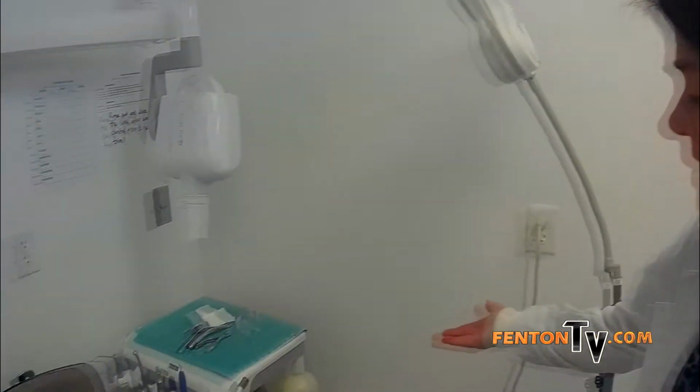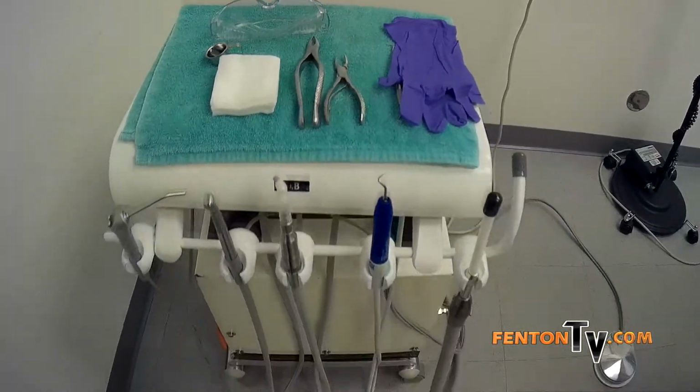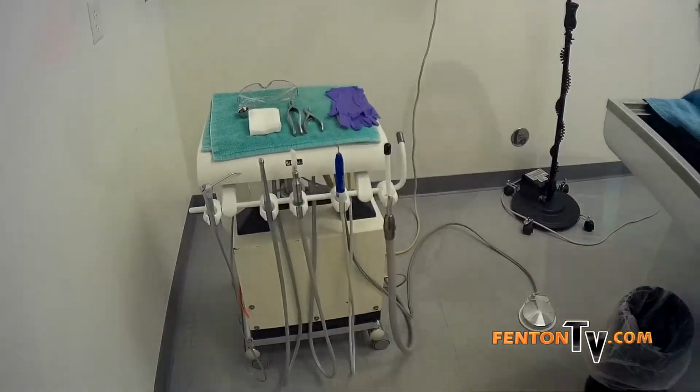So we have at our office a dedicated dental suite where I am currently standing. We have a number of instruments that are very important to our ability to do a dental procedure, which we call oral surgery. So I'd like to go through those with you just very quickly. We have over here a high-speed drill and an ultrasonic scaler and polisher. So what we do with these instruments is we scale off the calculus on the teeth. We do supra and sub, so above and below the gum line. Then we polish. If we don't polish, the teeth are actually more rough than we start, and it accelerates the rate at which dental calculus develops.